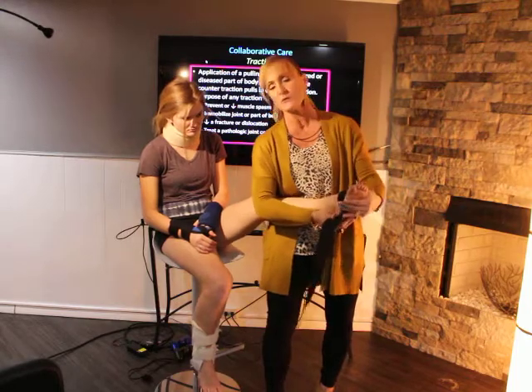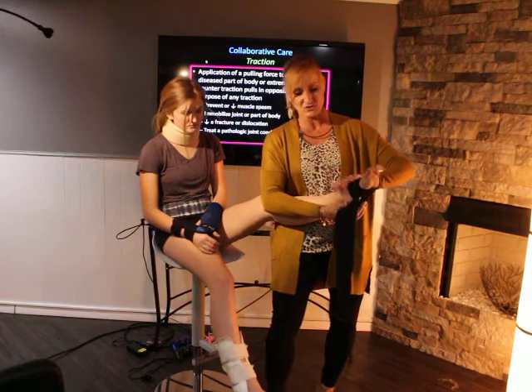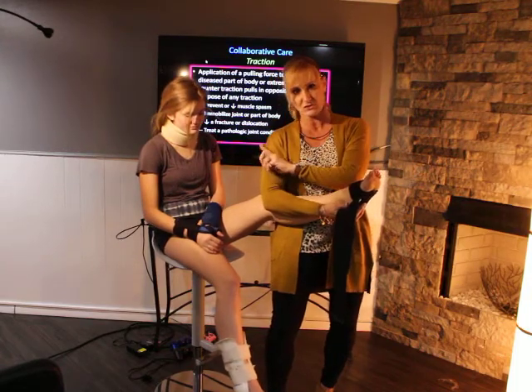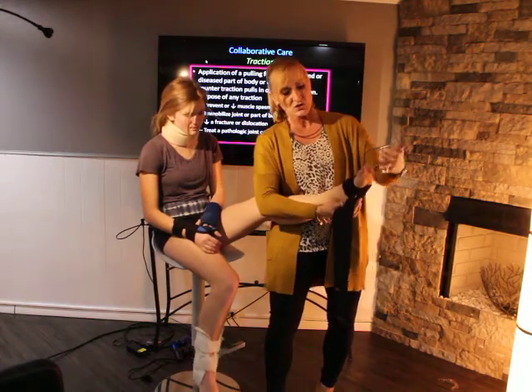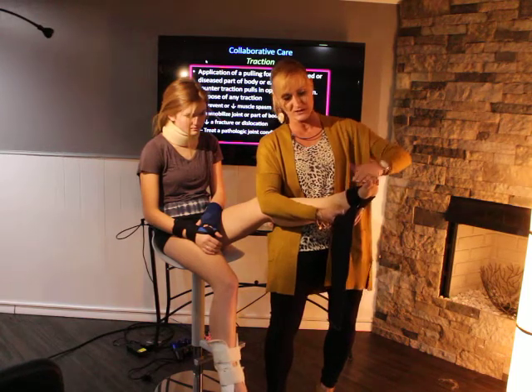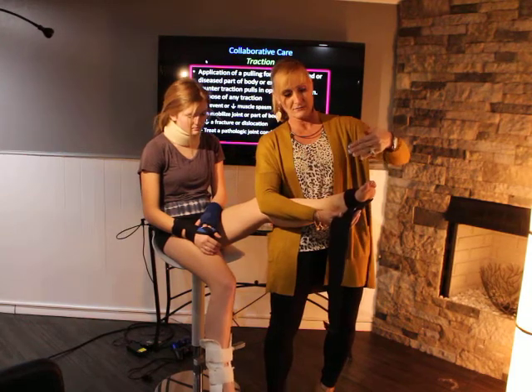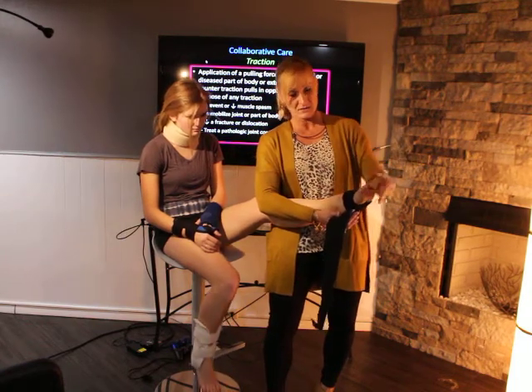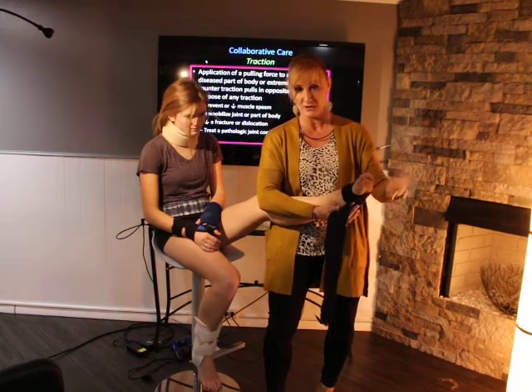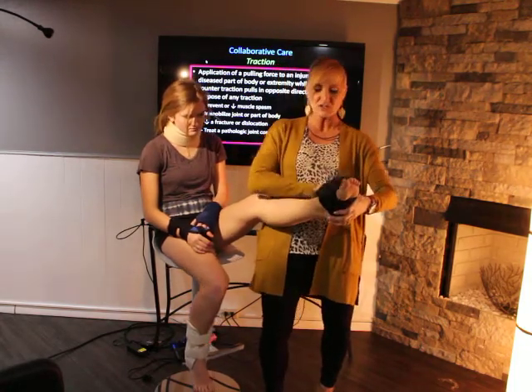Now when you are wrapping a sprain, and I'm going to show you how to do an ankle, and then I'm going to show you how to do a wrist, you're going to want to wrap it from distal to proximal. And the reason is you're going to want the swelling to go upwards rather than congregate down in her toes where compartment syndrome can start occurring. So you're going to put the base of it here, and then you're just going to slowly wrap it.